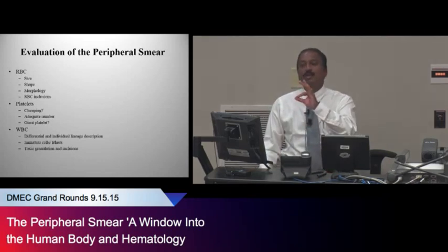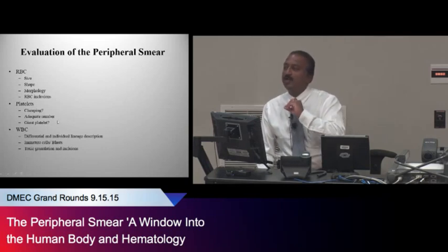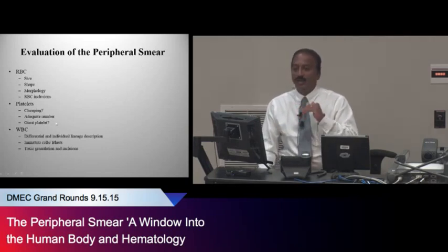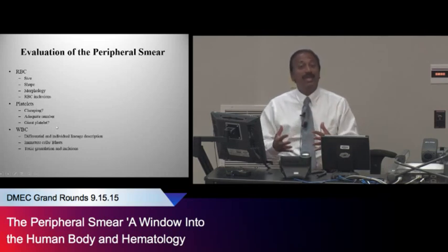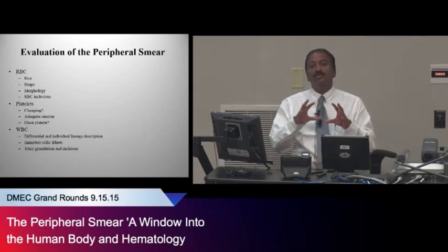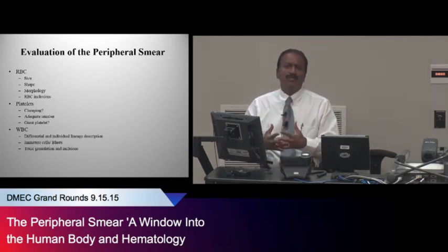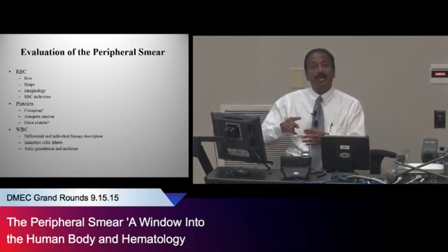So red, white, and blue, that's the easy way to look at it. And the W there, or the white there, does not stand for the white blood cell. Look at the red stuff, that's the red blood cells. The white is the background. Look at the platelets, because you have to look in the background for those little itty-bitty dots, and those are the platelets. And you don't really look at platelet morphology. They're too small. You can look at megakaryocyte morphology, but not at platelet morphology.